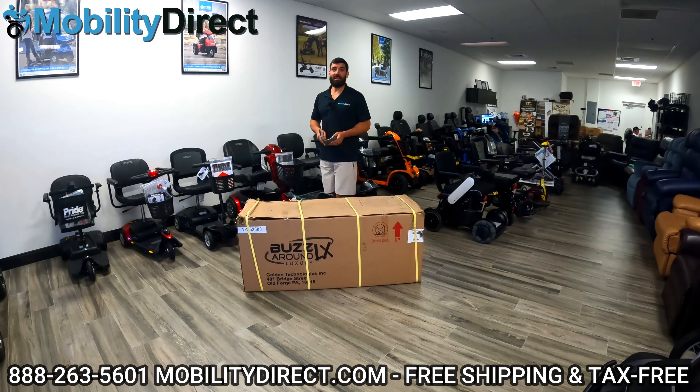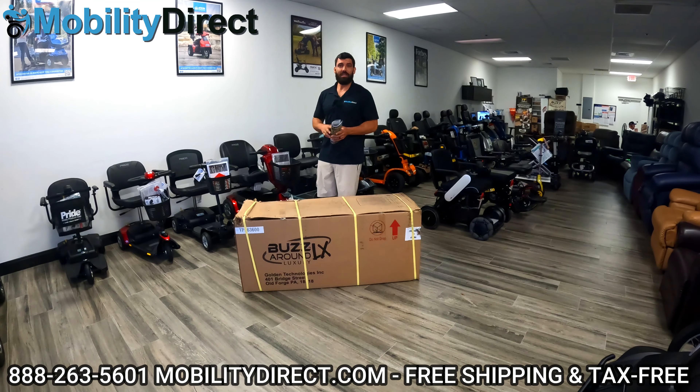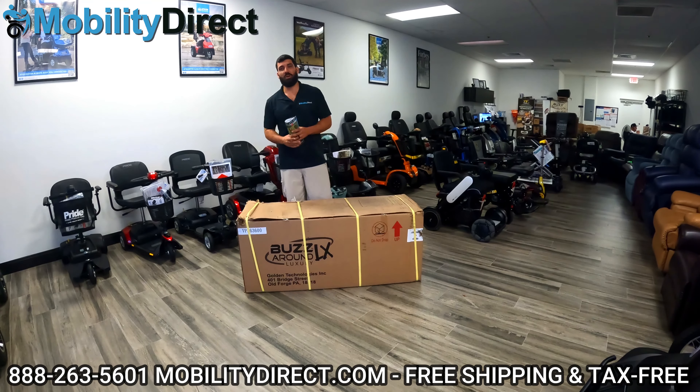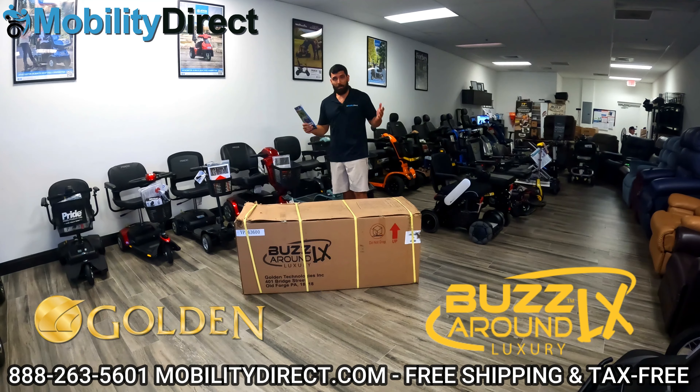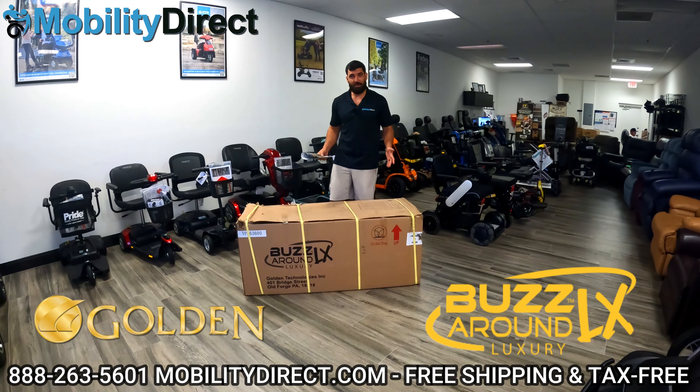Hi everybody, I'm Sergio with Mobility Direct, and welcome to our YouTube channel. Thanks for stopping by. In today's video, we're going to show you how to unbox and assemble the Golden Technologies Buzzaround LX model.